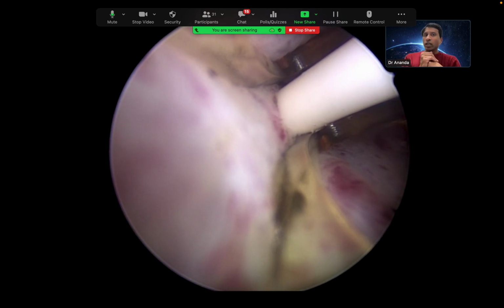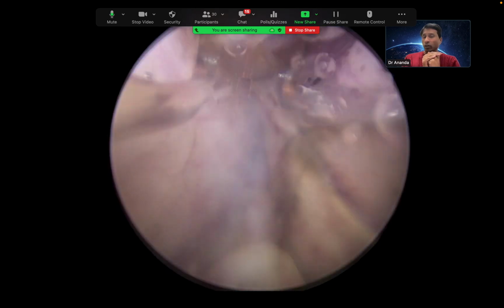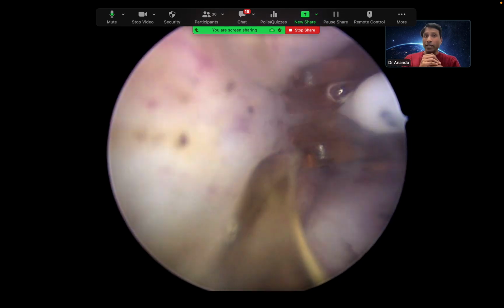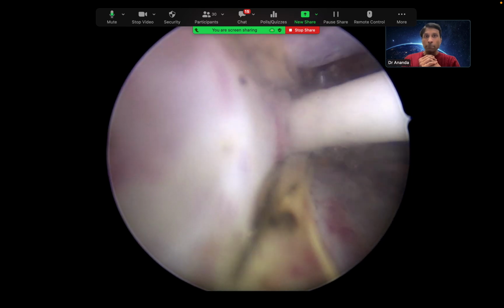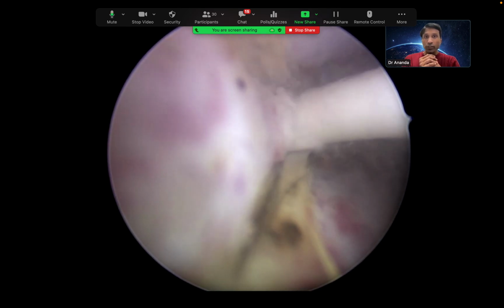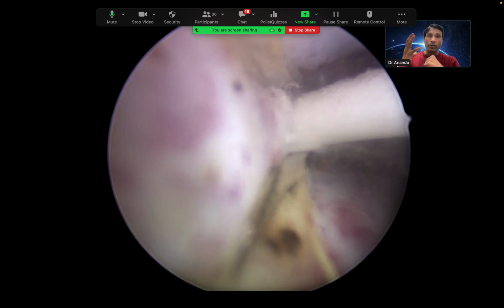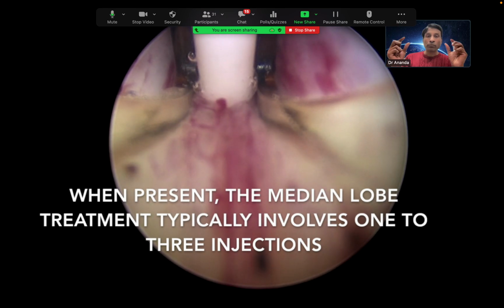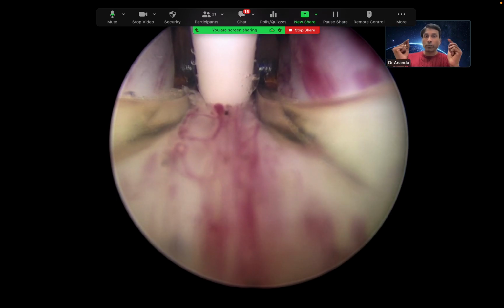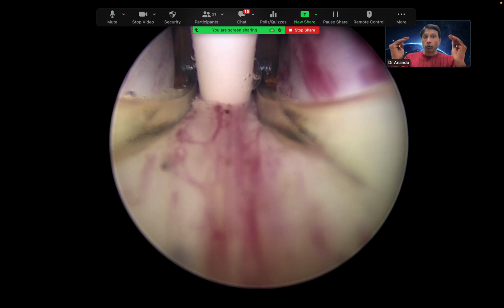Nowadays, there is some good evidence from Canada, from one of my good friends by the name of Dean Elterman. You may have met him during your SAU visit in Montreal. He has done some studies to show that there is no need to have 4 or 5 convective therapy treatments on the left side and right side. A good 2 or 3 treatments is more than enough.